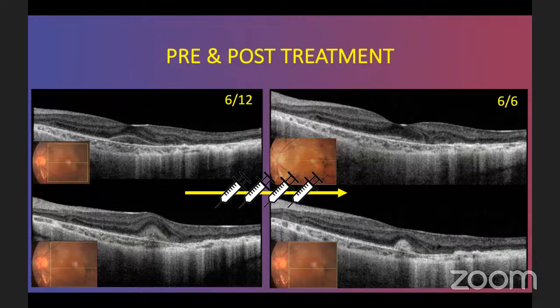Actually, one problem happens with OCTA. OCTA requires good fixation, and these patients, whenever they have BEST disease and go into the atrophic stage, don't have good fixation. So getting a good OCTA is very, very difficult in these cases. We should try to make them fixate properly. It's very difficult for them, but we need to try, and we need to see that there are very few artifacts. At that time I feel FFA will be better. If I have the option of ICG, that also will be good to look at. But yes, if we get a good OCTA picture with fewer artifacts, we can manage with OCTA alone, I feel.